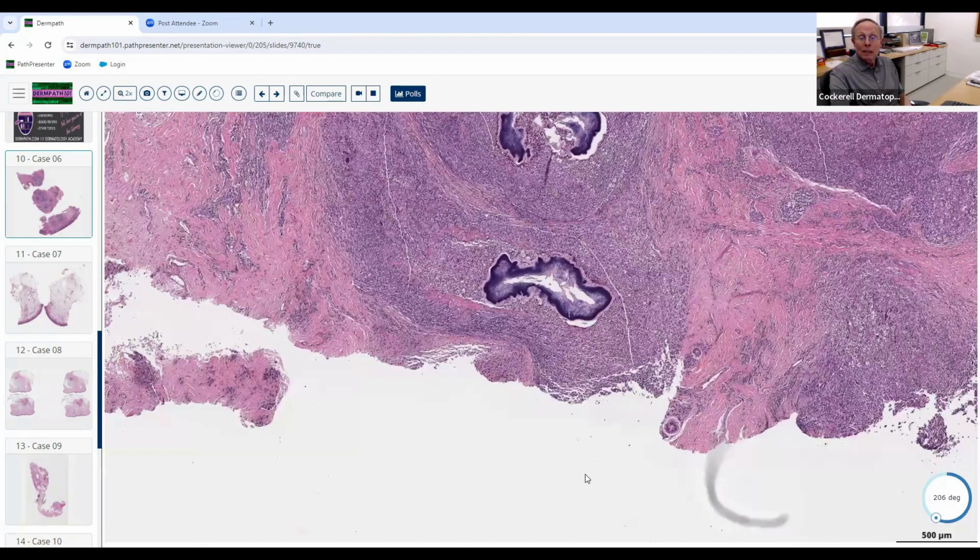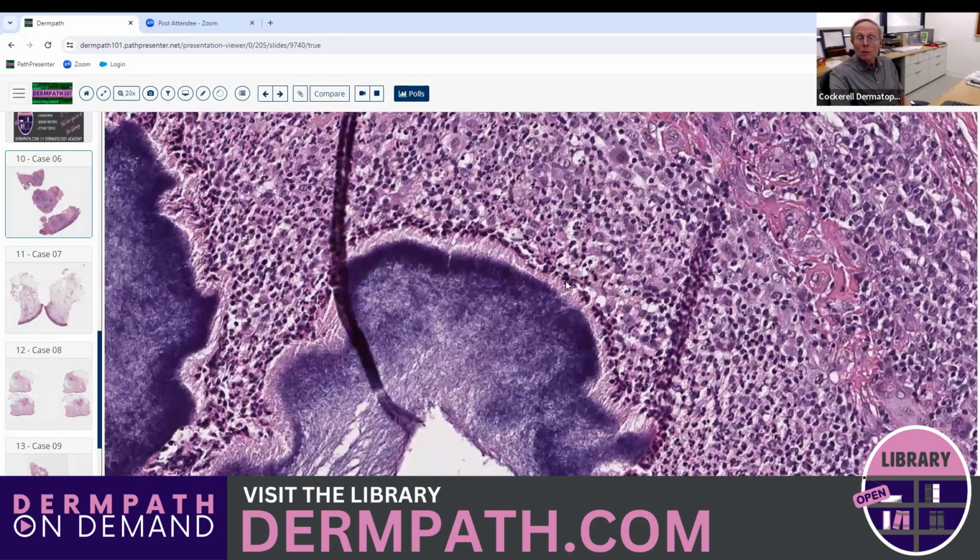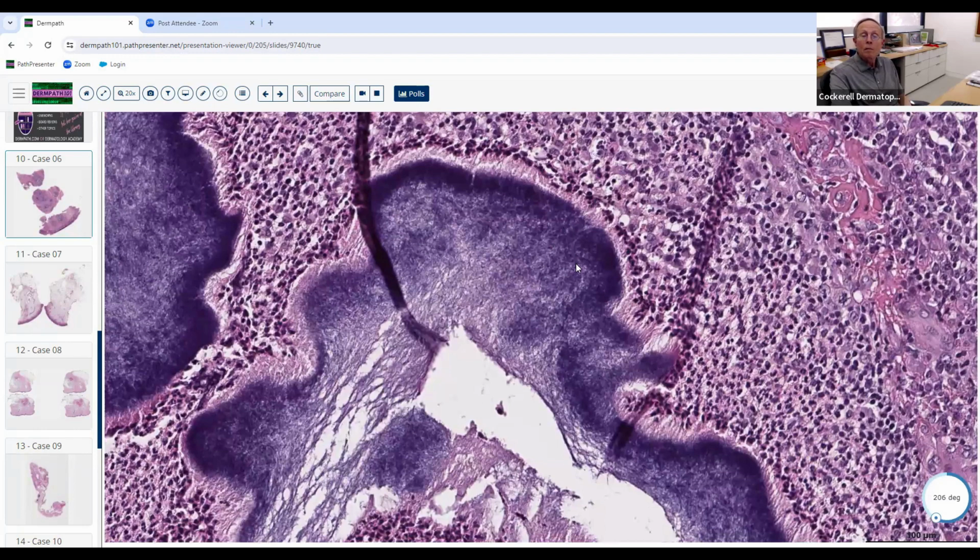Now, if this were a fungal lesion, what would you see? You would see the hyphae and branching. You see the hyphal elements, and usually the grains in something like a maduromycosis, the grains of a fungus, can be multiple different colors. They can be red, they can be black.